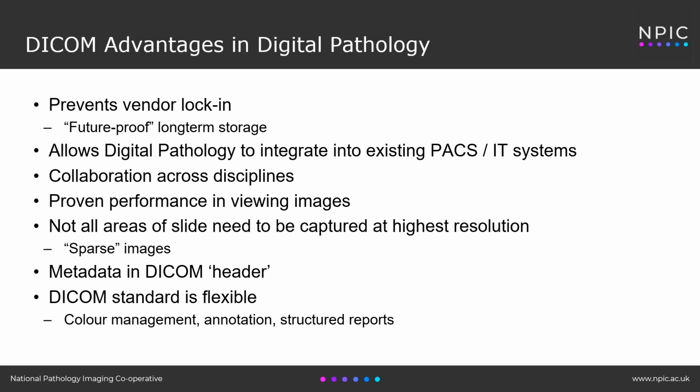Relevant to this, it allows collaboration across disciplines. So, for example, the radiology and digital pathology images from the same patient might be stored in the same PACS system, allowing interested clinicians to view them side by side, which could be particularly important in MDTs. DICOM has a proven performance in viewing images, so the end user, the reporting pathologist, should not notice any difference between the DICOM file and a proprietary format.